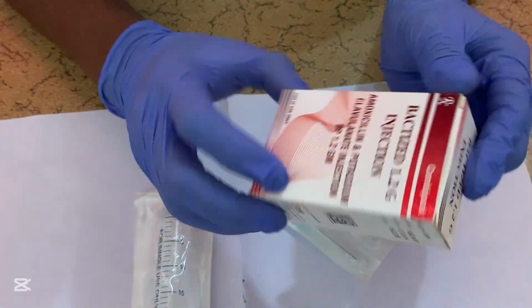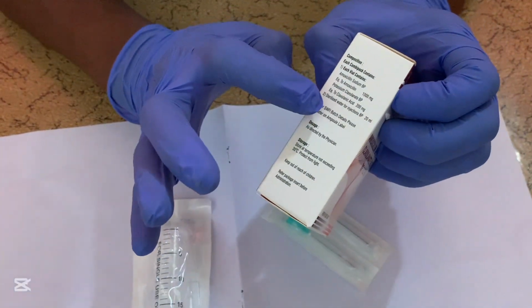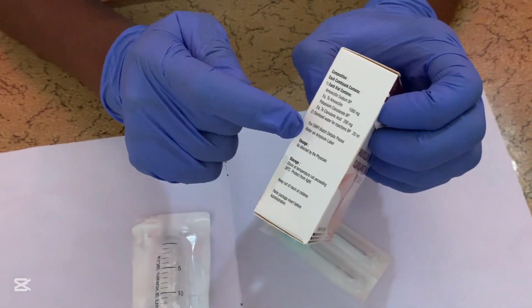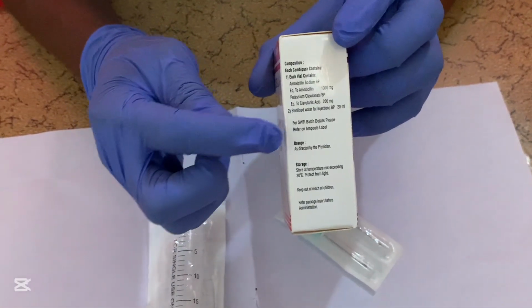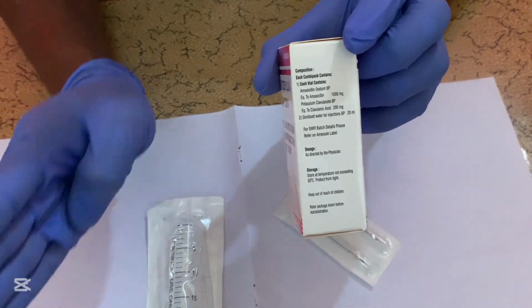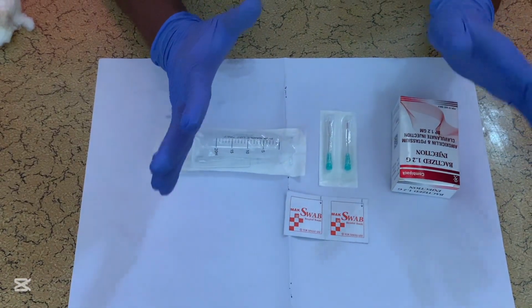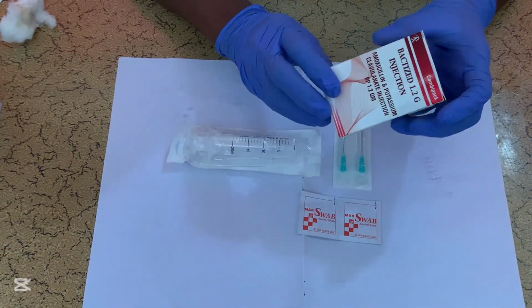Then you will also need to check the diluent. For example, sterile water for injection, 20 ml. You are supposed to reconstitute the drug with 20 ml of sterile water for injection or 0.9% sodium chloride. Let us start now. You get the drug.